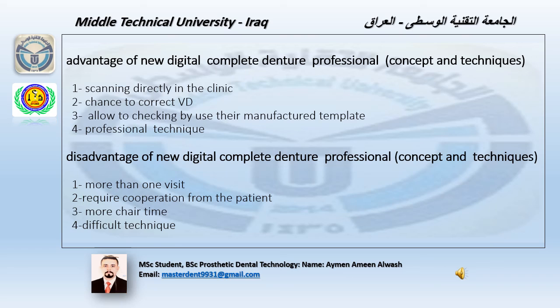Number 1, more than one visit. Number 2, requires cooperation from the patient. And number 3, more chair time. And number 4, difficult technique.